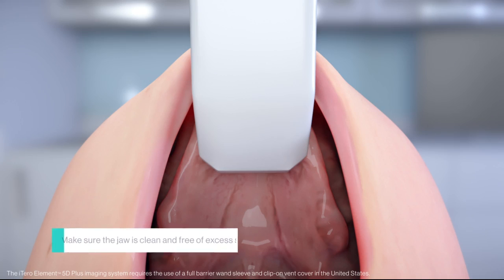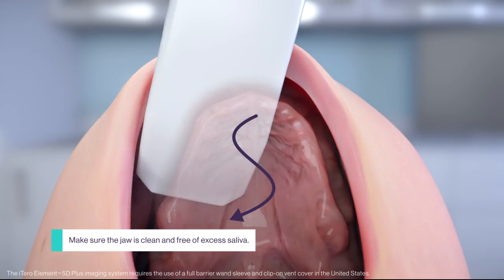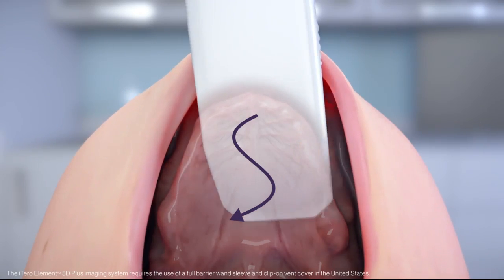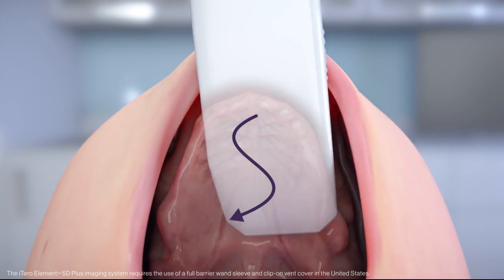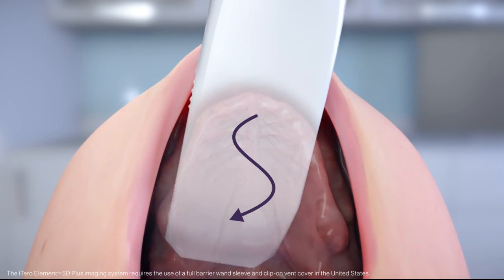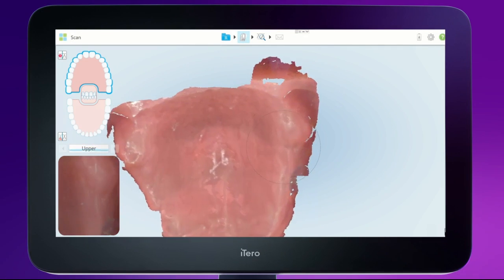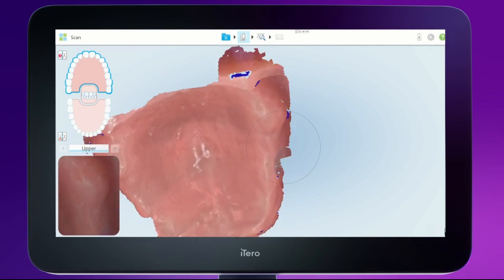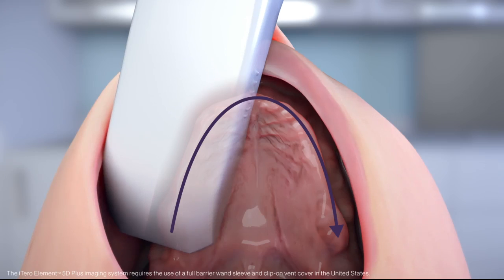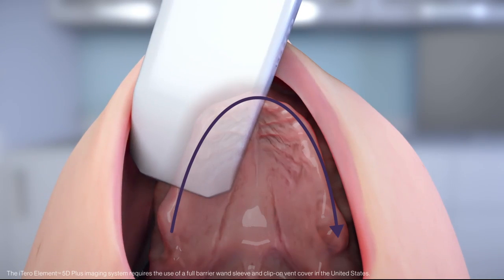Position the wand on the papilla and rugae. Turn the wand on and scan the palate in a wave-like motion. Scan slowly and steadily across the palate and capture the vibrating line. Capture the distal of the hamular notch and roll onto the ridge.